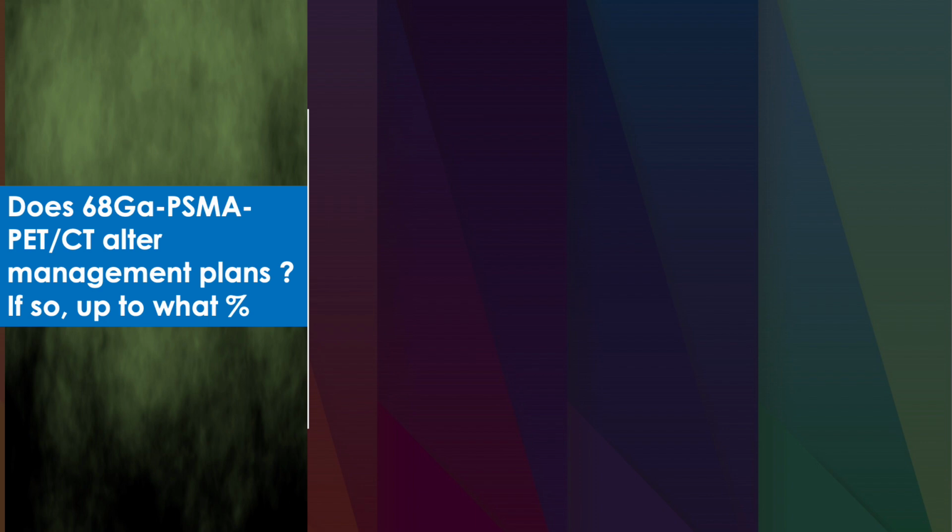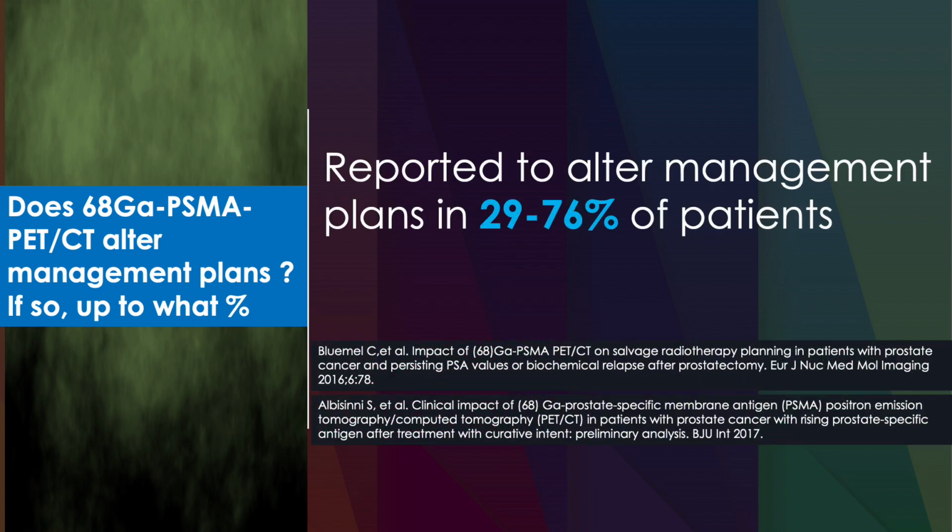And does gallium PSMA PET-CT alter management in patients with prostate cancer? And if so, to what percentage? In general, it changes the management in approximately 30 to 75% of patients. Therefore, PSMA imaging plays an important role in management of patients with prostate cancer.